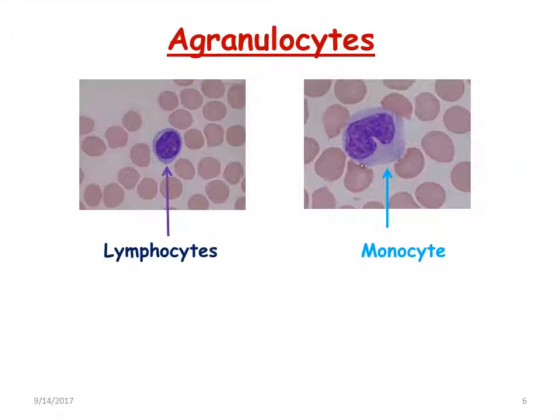The RBCs are present throughout, and alongside them you will find lymphocytes. The lymphocyte has a single nucleus with blue cytoplasm surrounding it. Then you have the monocytes, which are the largest white blood cells, also with a single nucleus but with a kidney-shaped nucleus.